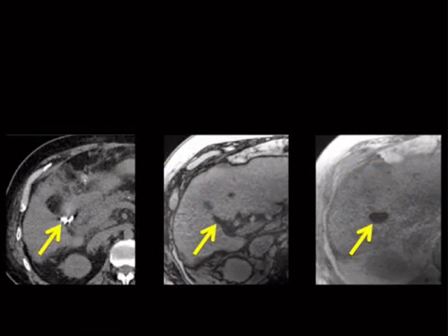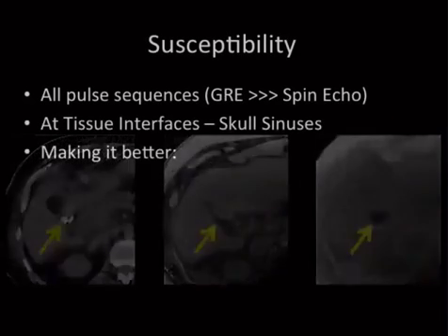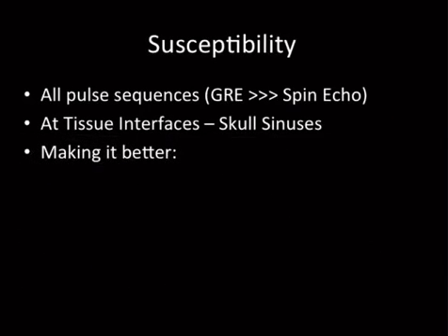So here's another example. We've got gallbladder clips, and this is time point 1 here, opposed, and then India ink artifact, and then here's time point 2, so this is 2.2 milliseconds, this is 4.4. Notice that it's blooming more and more and more, so that will just get progressively worse with the longer the TE. Just some general concepts, testable, of course, with regard to susceptibility.